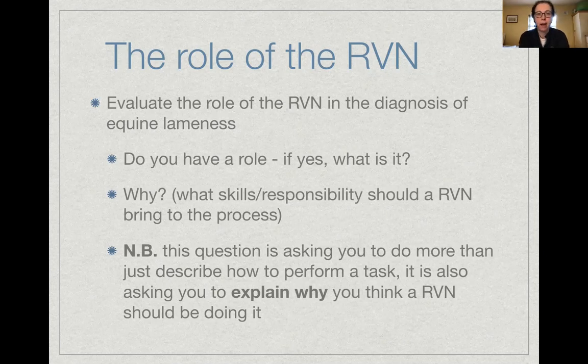You could talk about the fact that you're able to prepare the patient and the equipment to obtain good quality images. You can speed up the efficiency of the process because, for example, diagnostic imaging is something you can do at the direction of the vet. So you can take X-rays and then the vet just has to look at them to make a diagnosis, as opposed to spending their time in the imaging room obtaining high quality images.